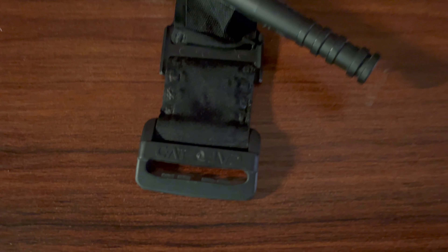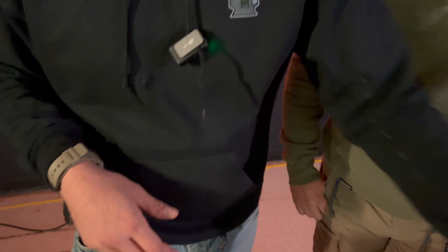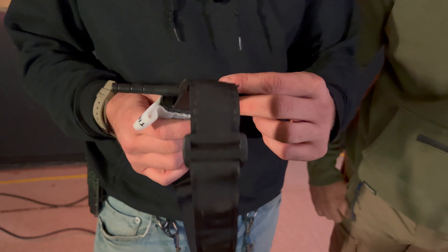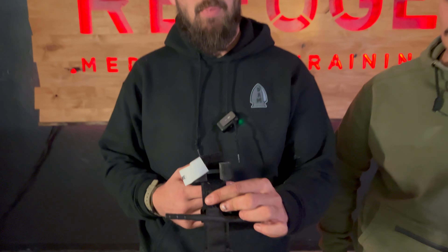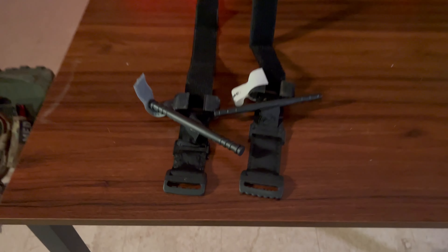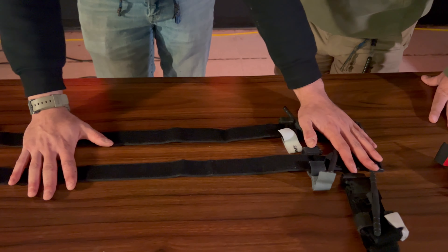Right here we have a genuine North American Rescue CAT Generation 7 tourniquet in black, which is their tactical color. We'll undo the time tab so you can see what it looks like — there is a Gen 7 CAT. This right here is a counterfeit Gen 7 CAT. This is not a real tourniquet in my opinion; it has not been battle-tested.